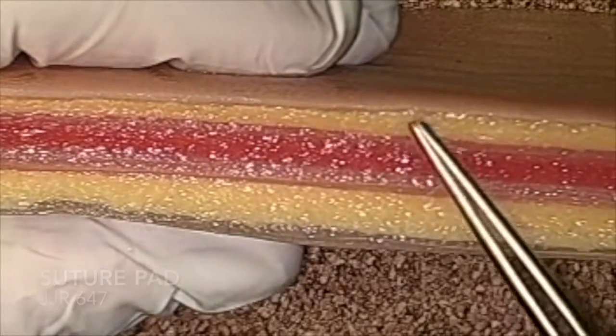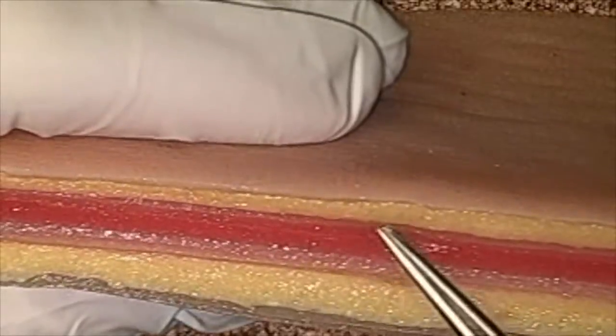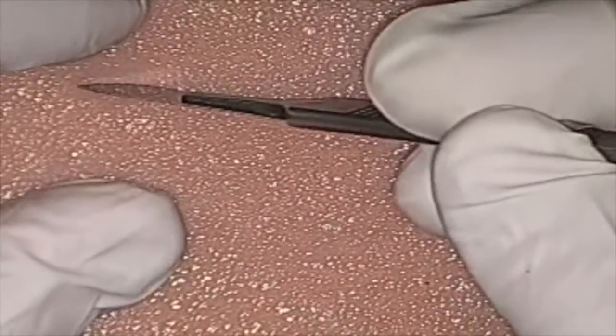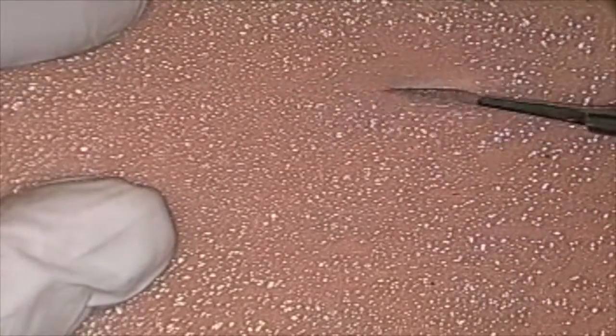This will be the exercise tutorial for the suture pad. This is a multi-layer pad, as you can see, so we can use each individual layer for different things. Focus on making your incision in an area where you can have multiple incisions on the pad. When you make your incision, make sure it's deep enough and goes down to the layer that you want to work on.